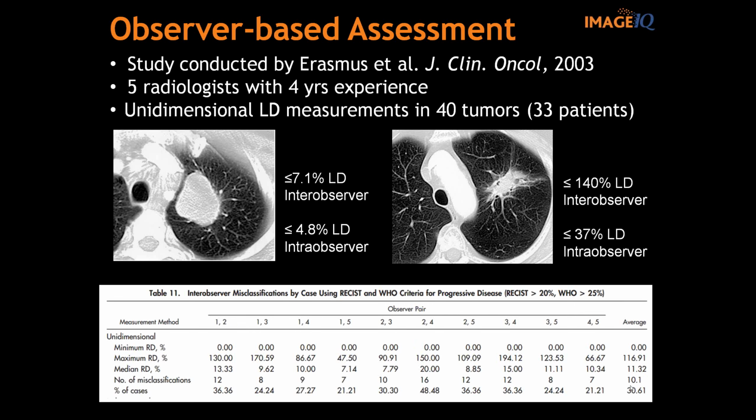Just to give you an example, this is a specific patient case study that we applied our software to. This was a CT scan of a patient on a 128 slice scanner with thin slice sections, 0.6 millimeter sections, reformatted to 3 millimeter increments, with contrast injected, as most studies do. In this case there were 2 specific time points. I chose these because they were far enough apart to see the differences. Obviously, for a trial, you may have more time points between those, but these are 17 months apart.